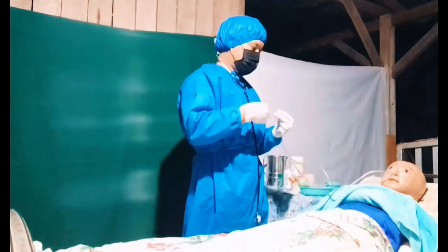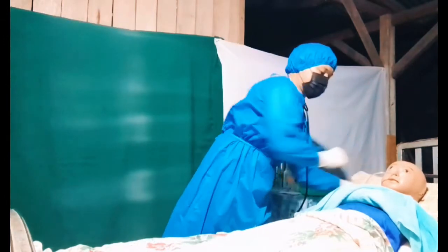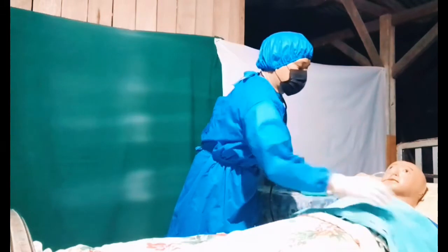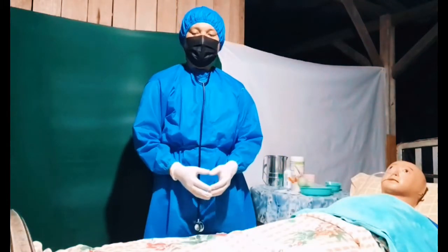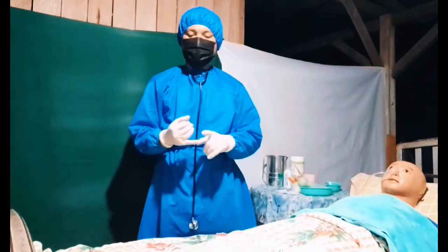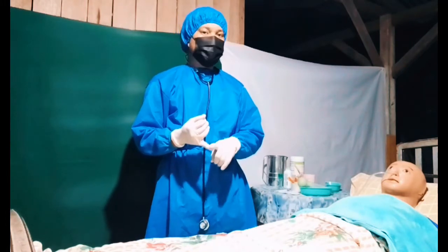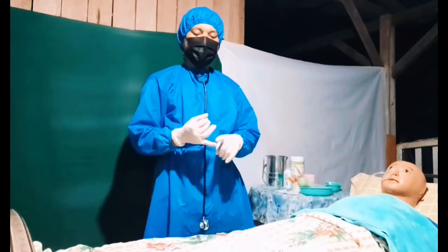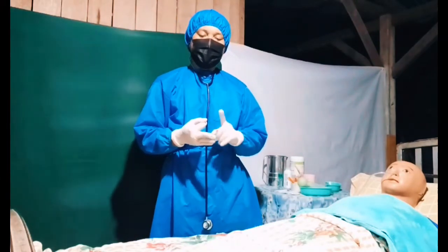Lock the tube and put it behind the pillow. So we're done with the insertion and the lavage. After all the procedure, you must document the vital signs before and after. Also the reaction of the patient before and after. Time and date. That's all.